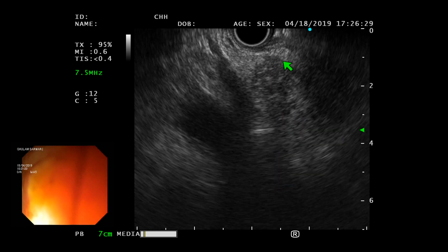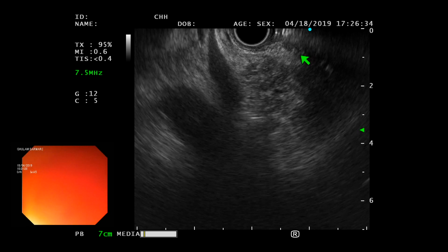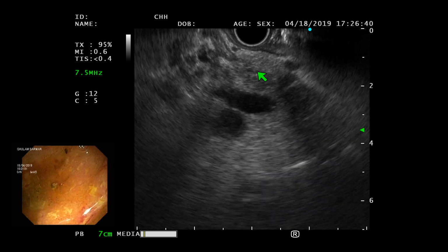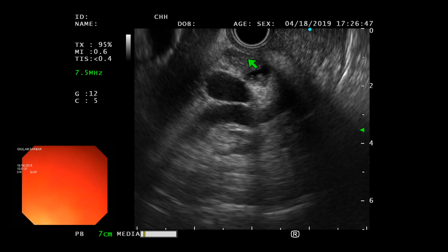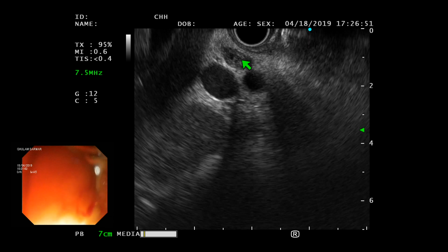What I can see properly is from the D2. So here, this is all the duodenal lumen. I kind of lose the bile duct in this area when I get to the pancreatic head. But I'll show you that from D2 in just a second. But look at this, look at that, that's the bile duct. Look at the cystic duct right there. And the cystic duct is right there.